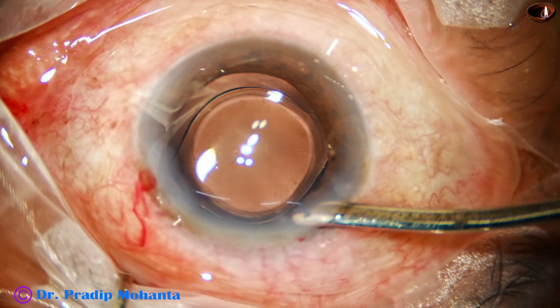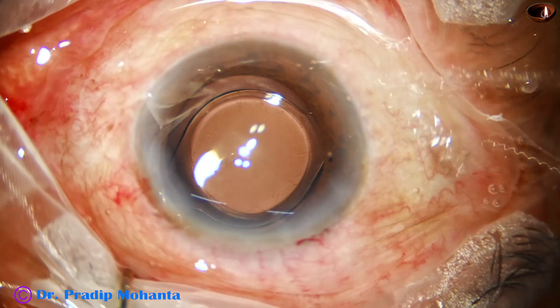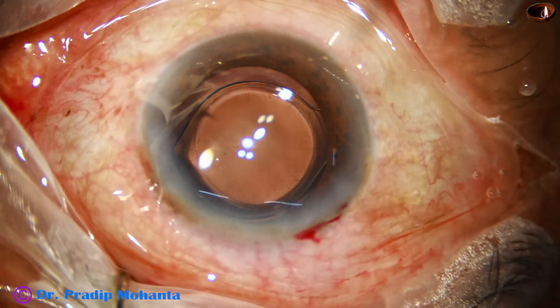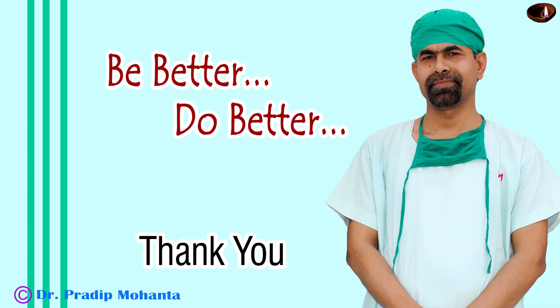And if we have a variant, we can get a good guide to redo the rhexis. Femtosecond laser just for rhexis is a bad investment — this is my personal opinion. Thank you very much for your attention. Hope this video will help you in developing your surgical skills. Be a great surgeon and serve your patients with love, respect, empathy, and great surgical competence.